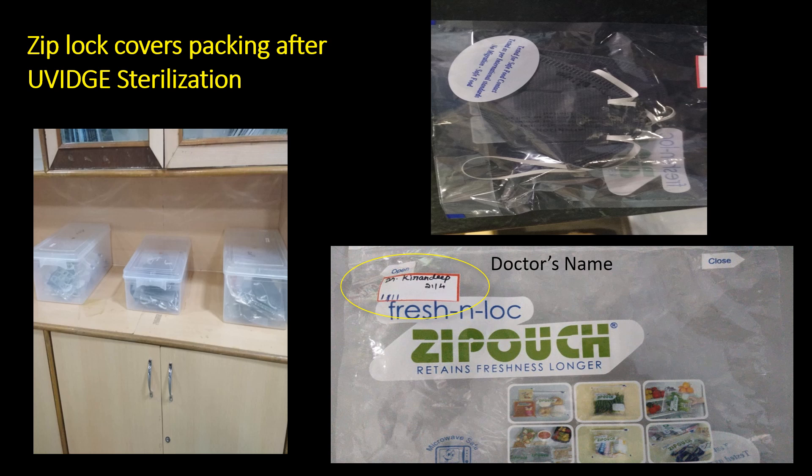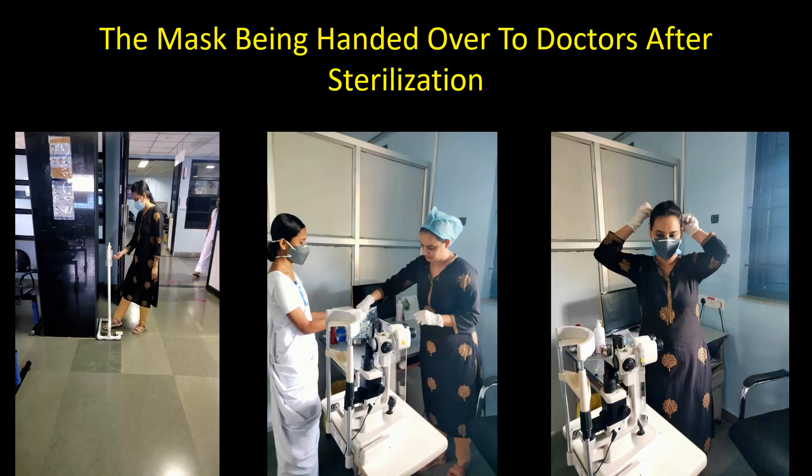The masks as well as the ziplock bags have the name of the doctors written on them so that they don't get mixed up. When the doctors come for duty in the morning, they can directly go to the UVic area and collect their respective sterilized respirators.